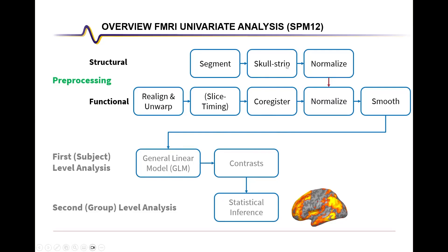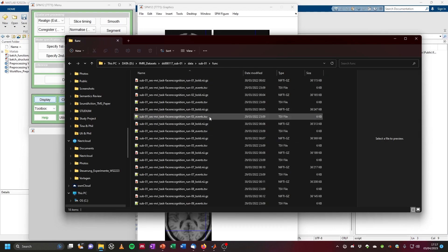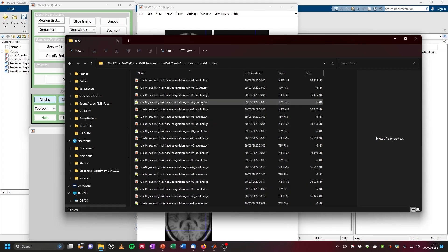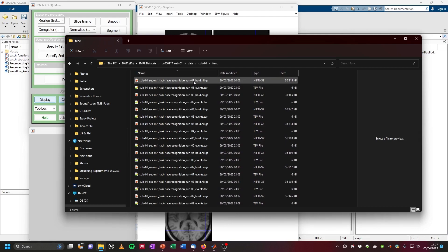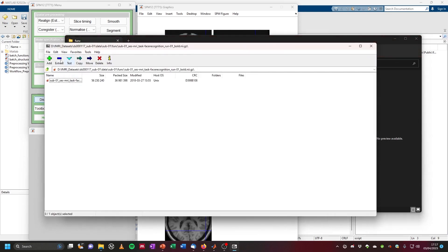Once structural preprocessing is done, we can continue with preprocessing of the functional images. In the BIDS data structure, we have a folder called 'func' where all functional images are located. Most of the time we have multiple runs within each subject where the scanner was turned off and on again. These are typically in .gz archives, so we want to first extract them. Let's work with the first run — we can open with 7-Zip and extract it.